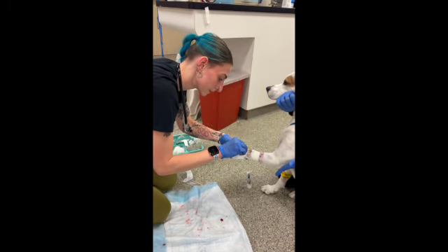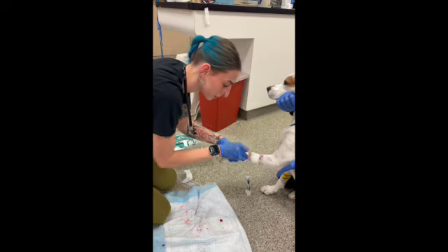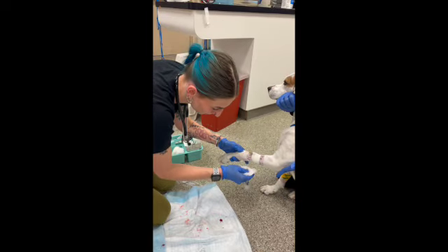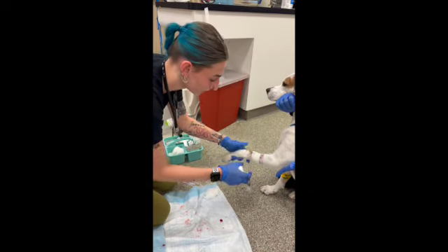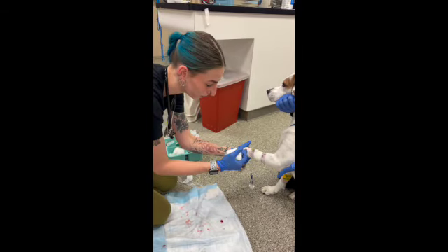All right, now that it's taped in, I usually just like to wipe off any blood so that way it's a little bit more clean for our patient. And then we will just start wrapping. Because it's right above her carpus, I'm just going to wrap right above that.